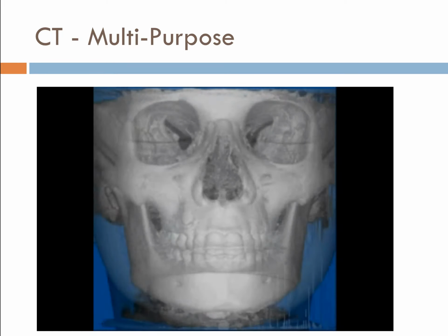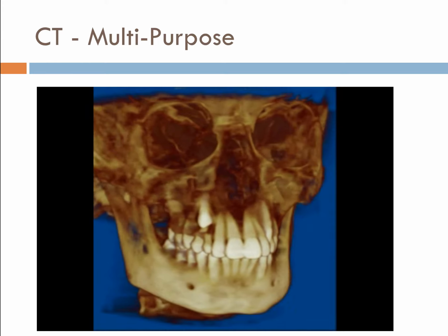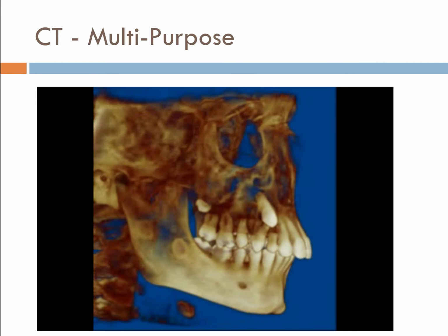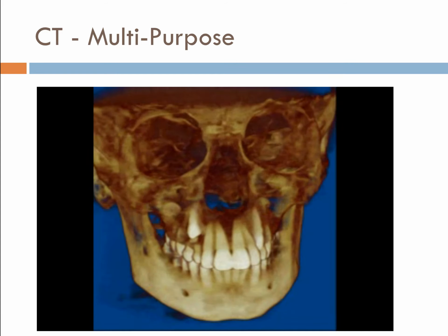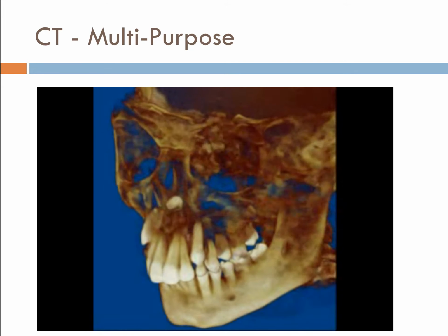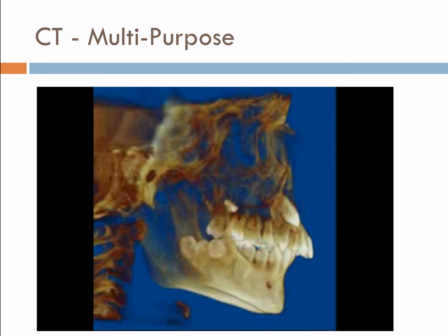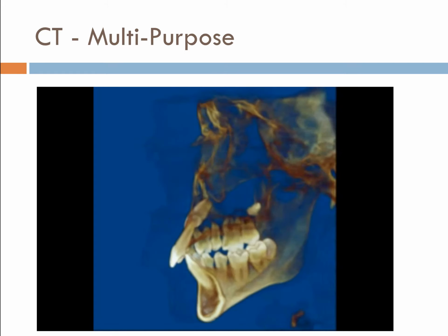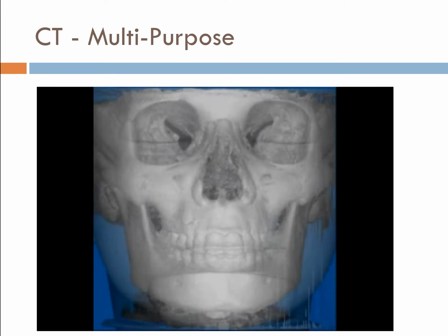If we look at this one, this is a slightly different CT. Some of you might have had this performed before, what's called a cone beam CT. It's used for dental architecture. A lot of places are using this now for planning very expensive dental treatments, the extraction of teeth and the realignment of teeth with braces. It's also used for trying to position dental implants and all of that sort of stuff. This is once again a CT technology, where one acquisition.